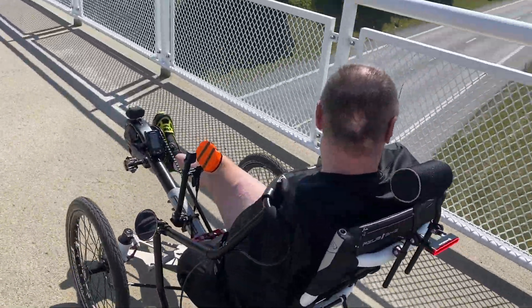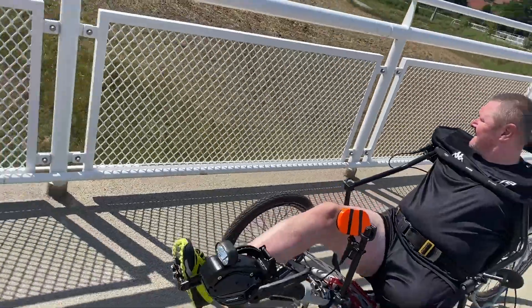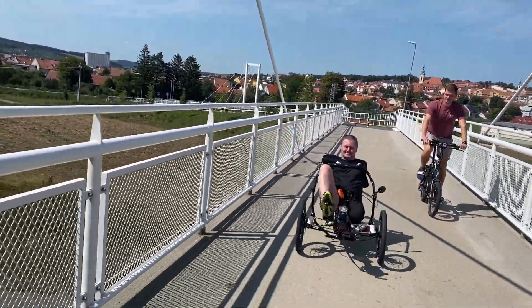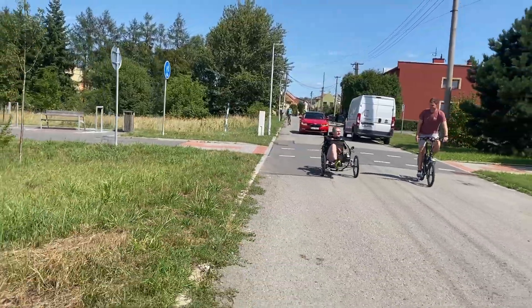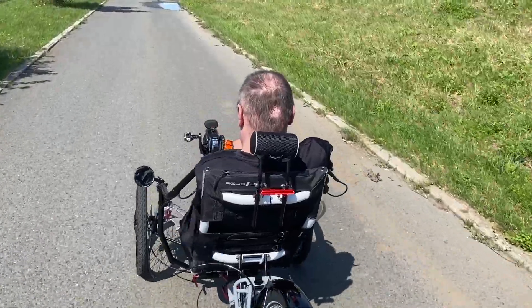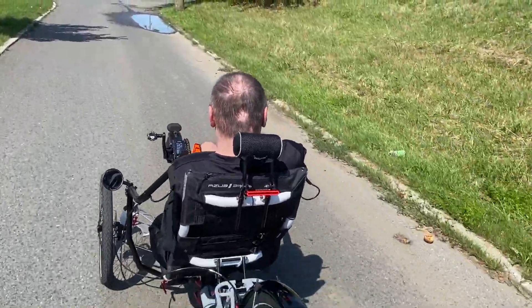Working on the project of a trike which Mr. Hoss powers only by one leg and controls only with his body without the involvement of arms was a great challenge for the entire ASAP team. And we are thrilled that we succeeded.